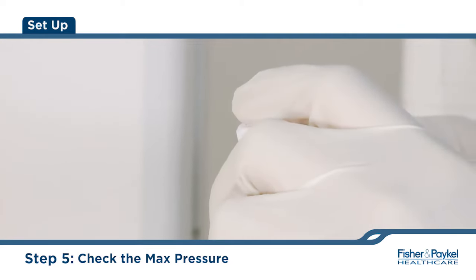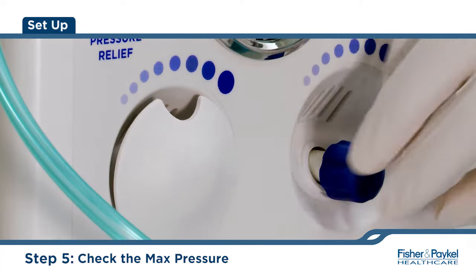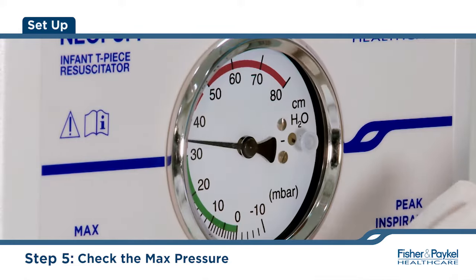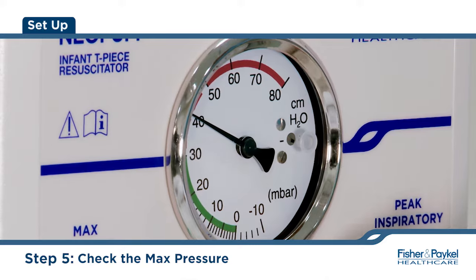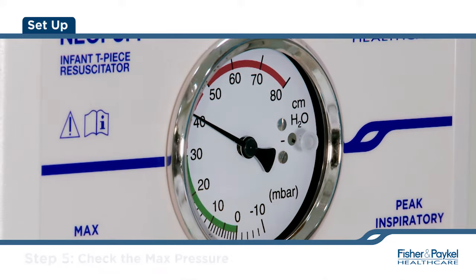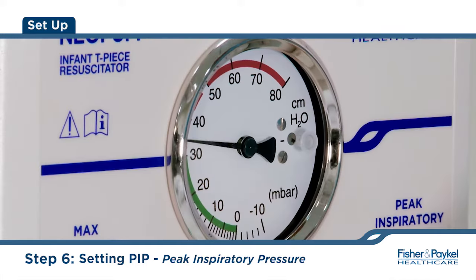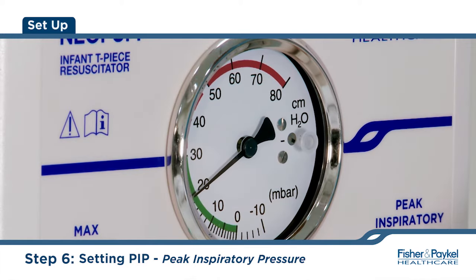Check the maximum pressure by occluding off the PEEP cap and turning the PIP control fully clockwise until the knob doesn't turn anymore. While still occluding the PEEP cap, turn the PIP control knob counter-clockwise until the desired peak inspiratory pressure is set.